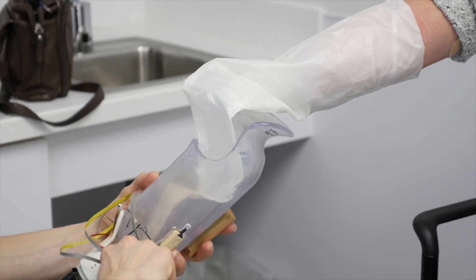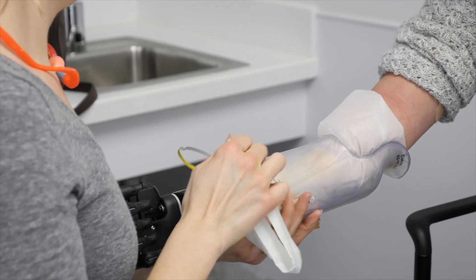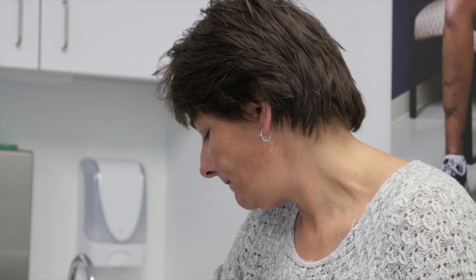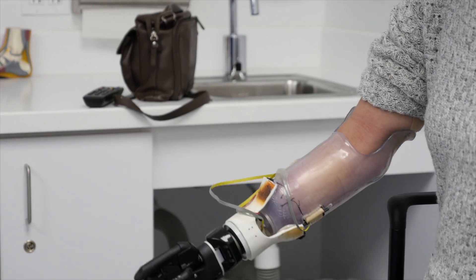It needs to be a nice intimate fit, and all of the suspension is from her anatomy. It's not from a harness, it's not from anything else. So it needs to be that tight, loose fit — she needs to be able to get it on, but it needs to be snug enough that it's going to stay on.